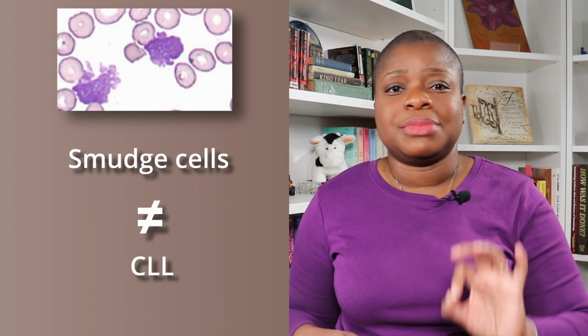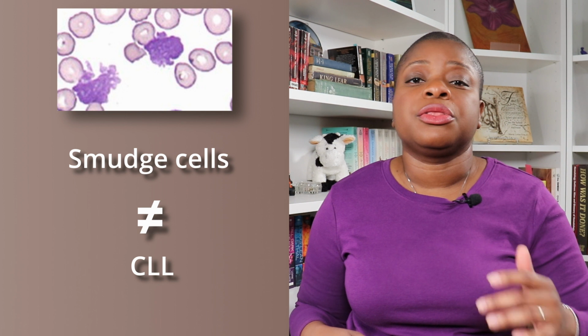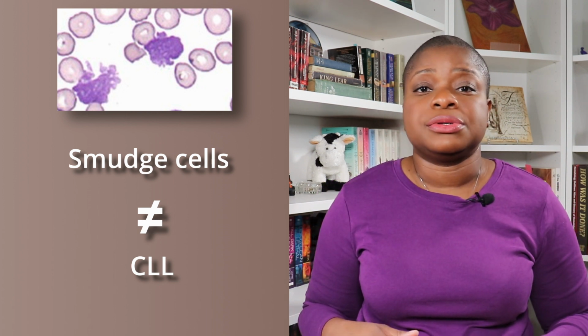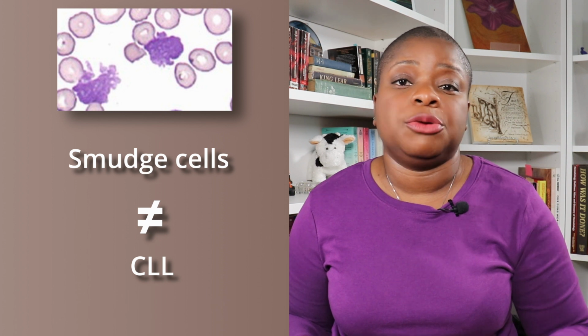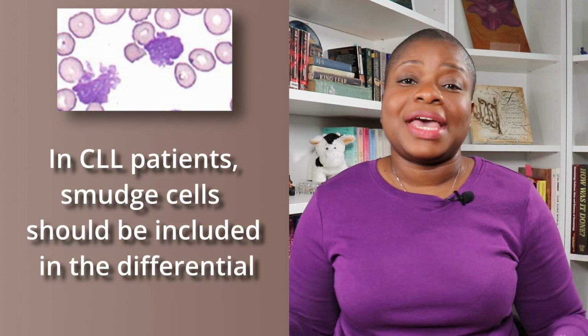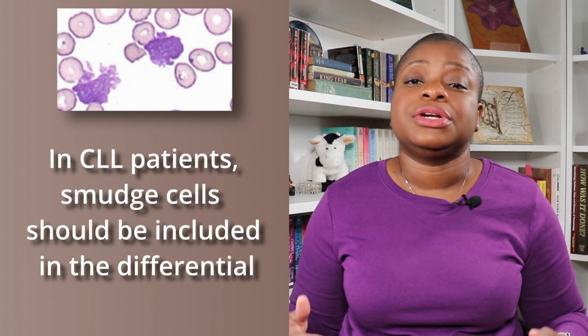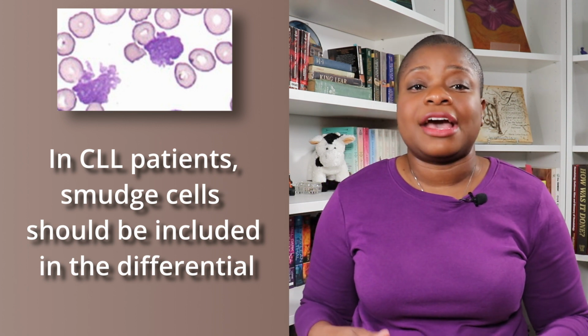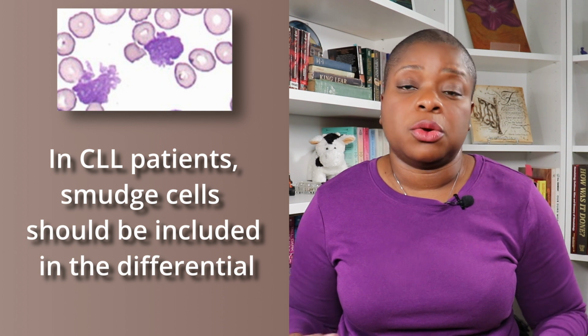Do not assume that if you see smudge cells that you are looking at CLL. They can be found in reactive lymphocytosis and other lymphoid neoplasms. In CLL patients, smudge cells should be included in the differential. Your institution will dictate how they are counted and the procedure employed.